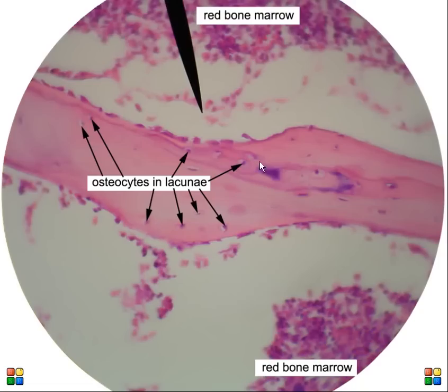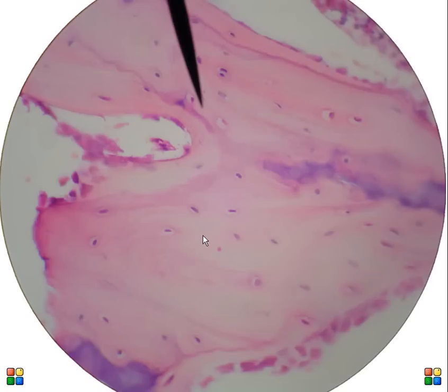Here's a labeled picture again from my website: red bone marrow, the actual bone tissue, osteocytes living in lacuna, and red bone marrow again down here. Another high magnification image of the bone tissue shows osteocytes living in lacuna. If we have multiple lacuna, we call them lacunae.